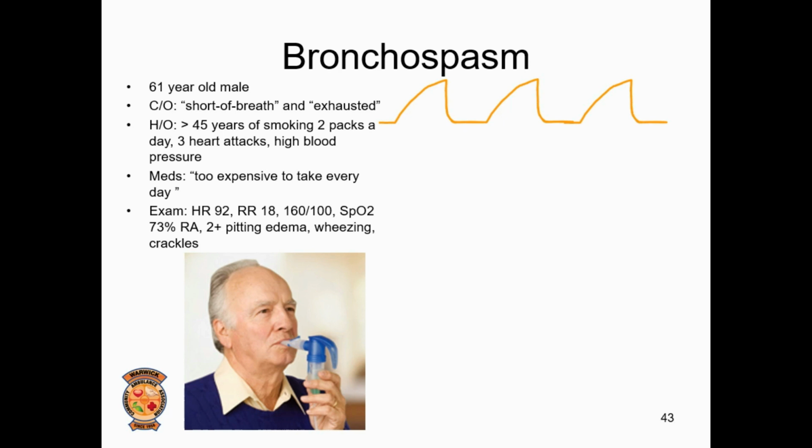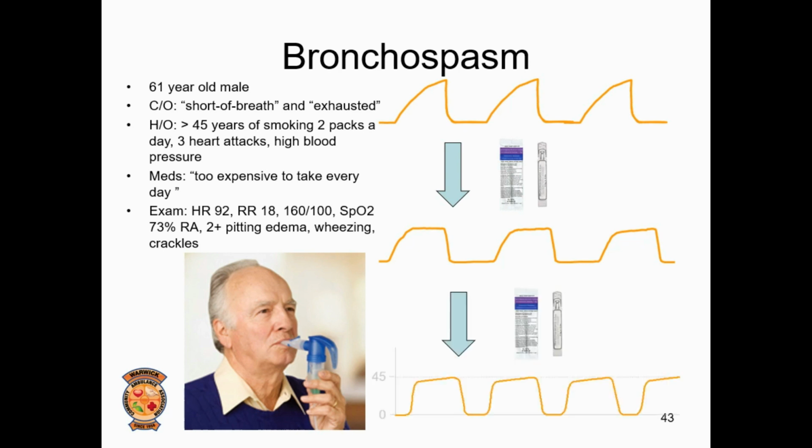You'll notice that after the first DuoNeb treatment, the patient's alveolar plateau returns slightly, and after the second DuoNeb treatment, the patient's capnogram returns to normal. If you're using the LifePak 12 or LifePak 15, you can hit the print button twice in between the DuoNeb treatments to document the patient's improvement. And I say LifePak 15 or 12 only because that's the monitor that I'm most familiar with and haven't used many of the other monitors recently.